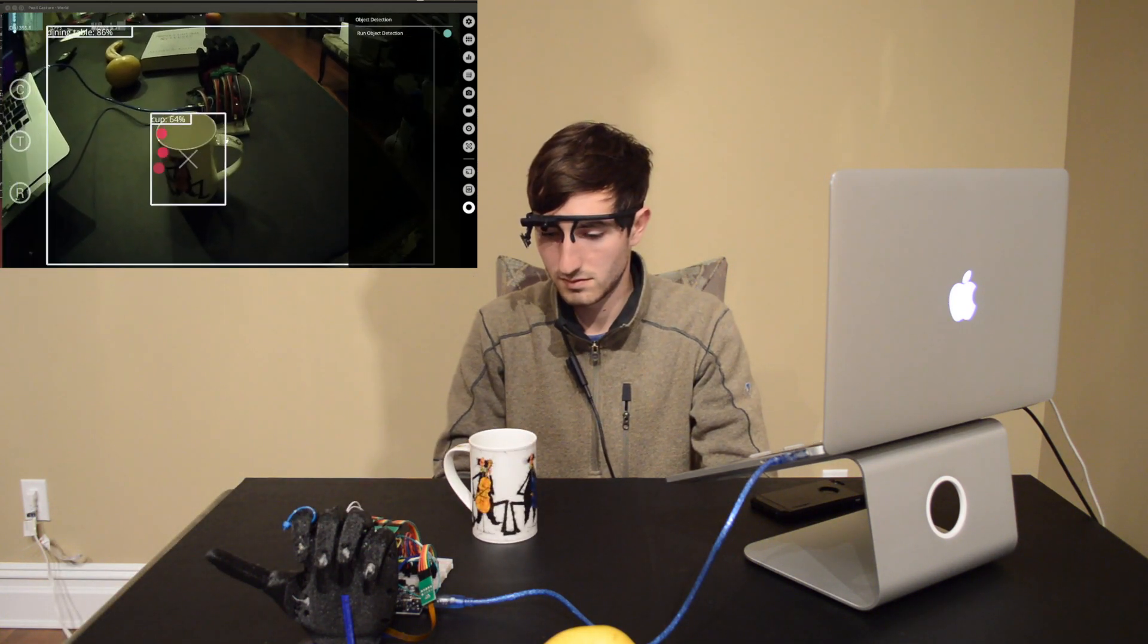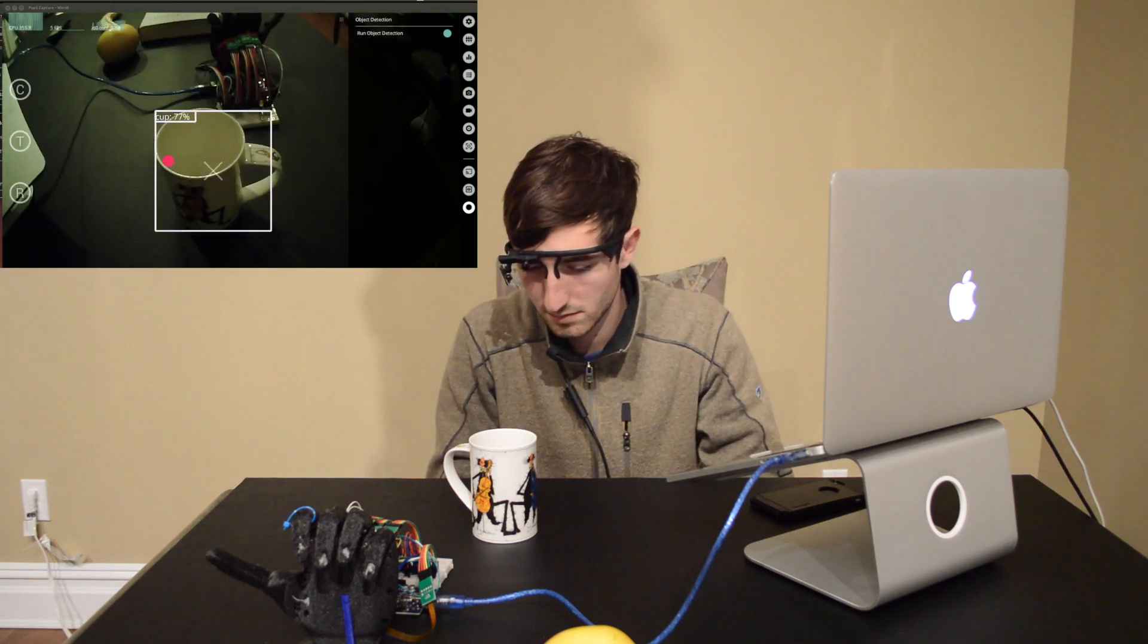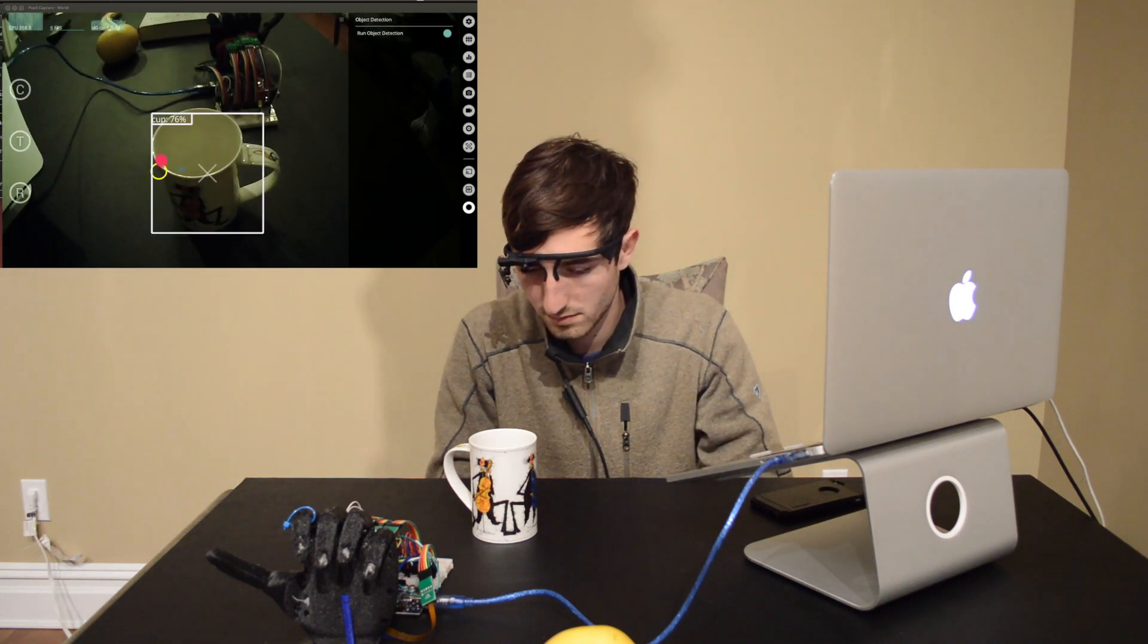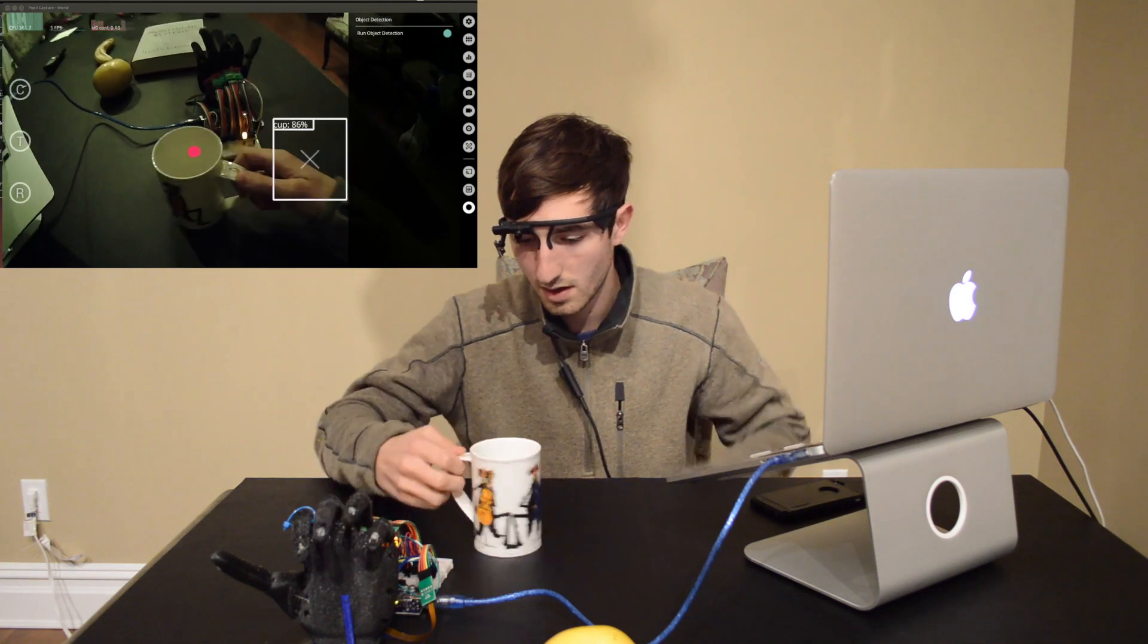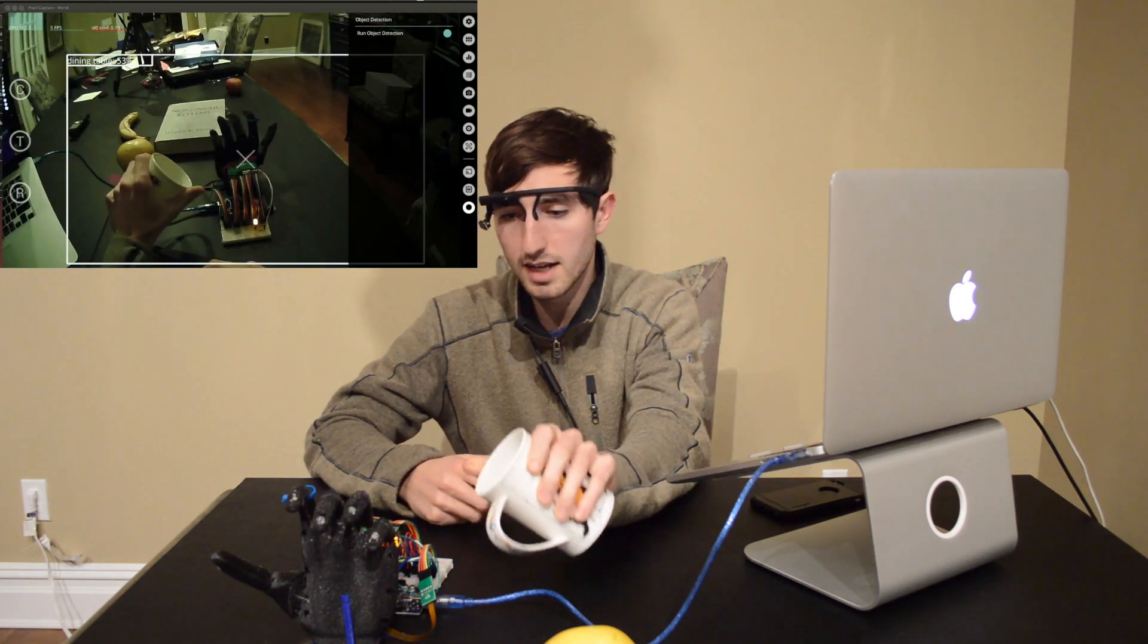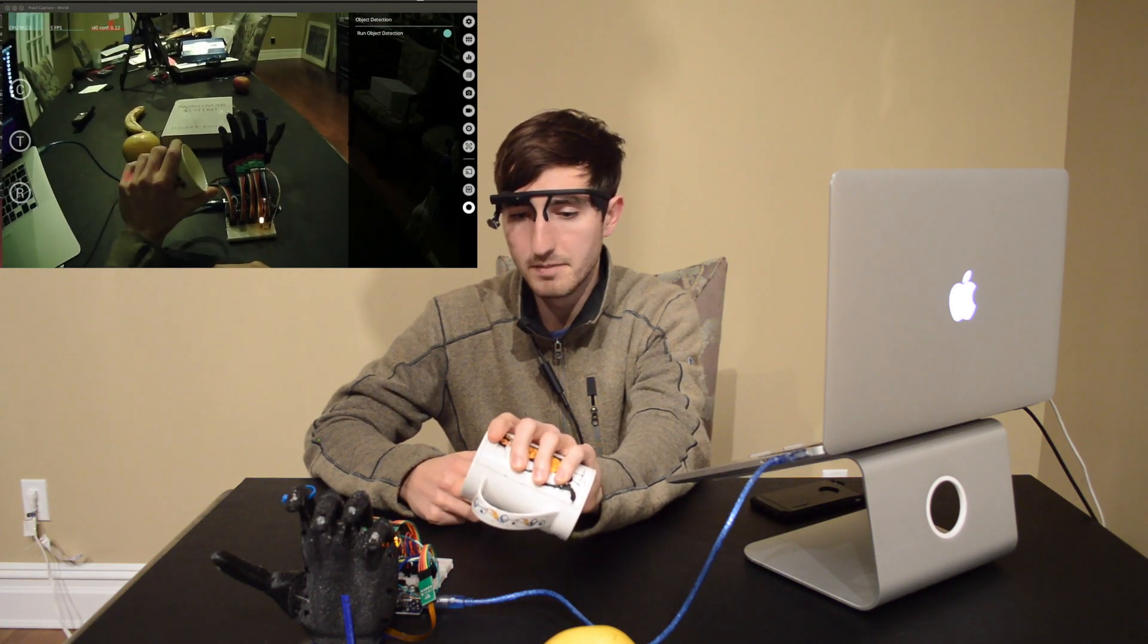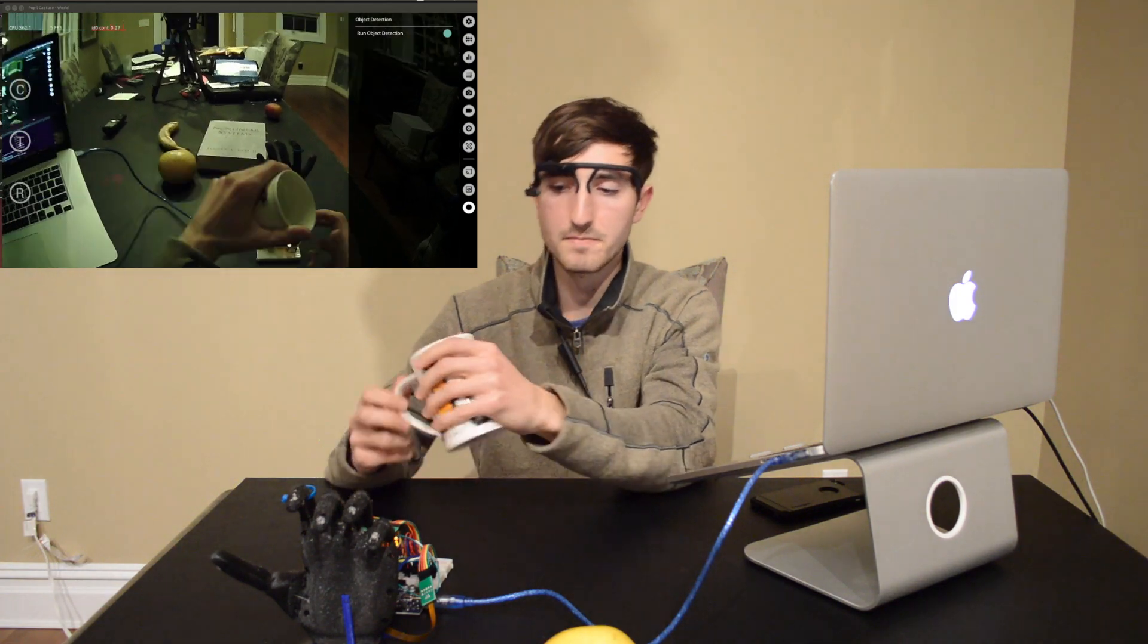So what's going to happen now is I'm going to look at an object and if there's an associated grasp with that object that I've already hard-coded in, then that grasp will be performed by the hand. So let's take, for example, let's try the cup. Okay, so we'll see that we've got a cup grasp here.